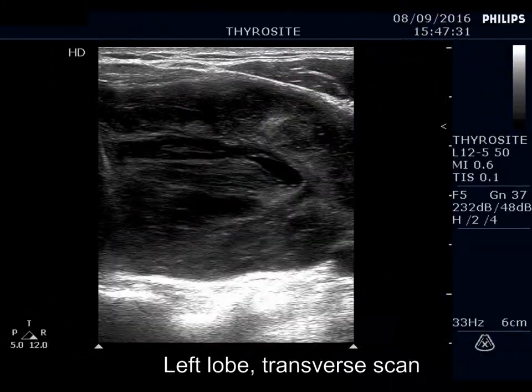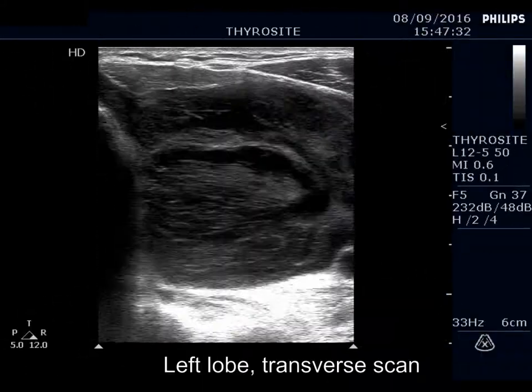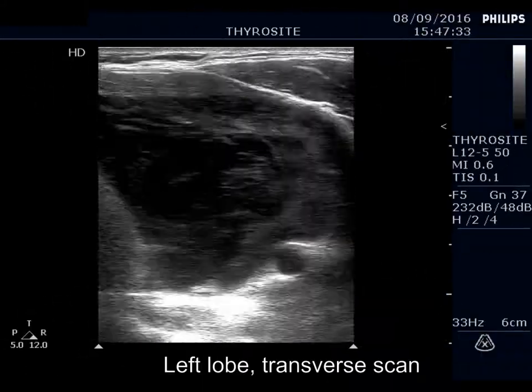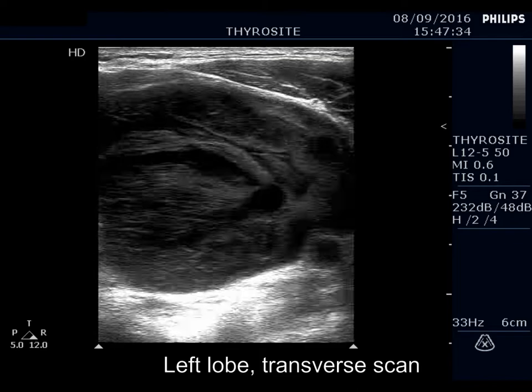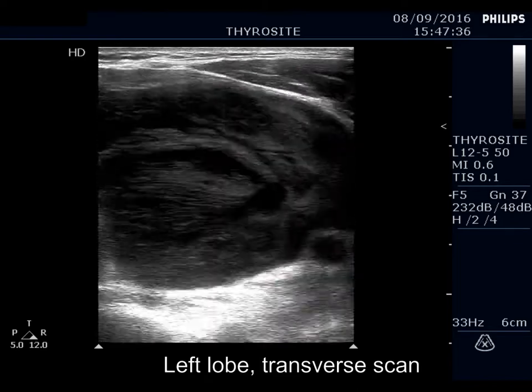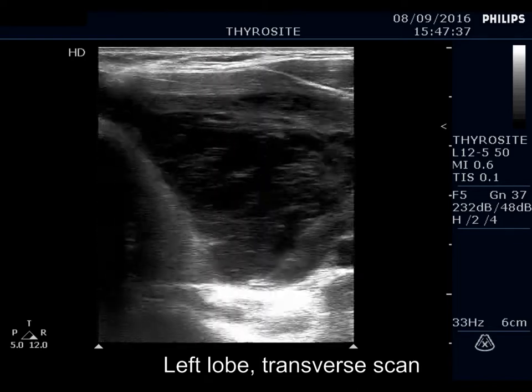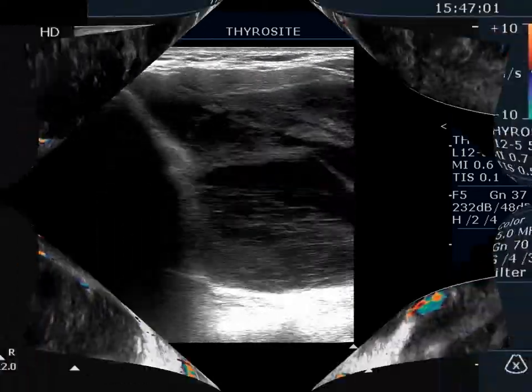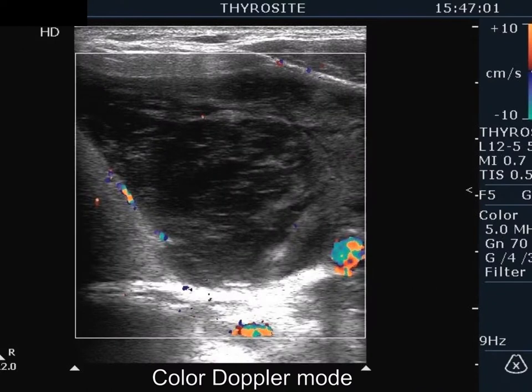Dorsal to the deeply hypoechoic areas, echogenic lines and granules can be observed. The lesion has a single vascular spot within.